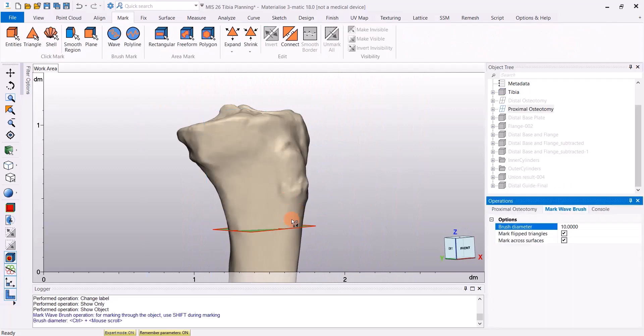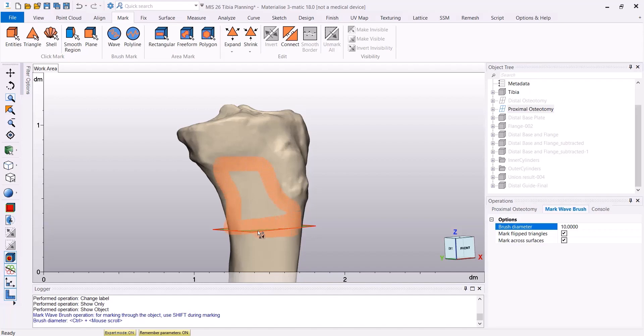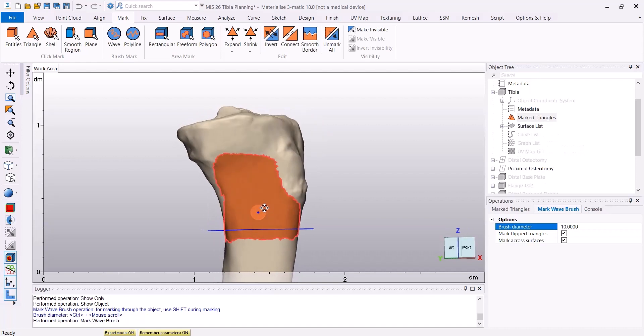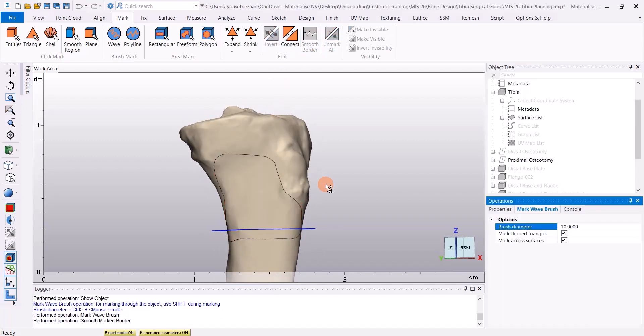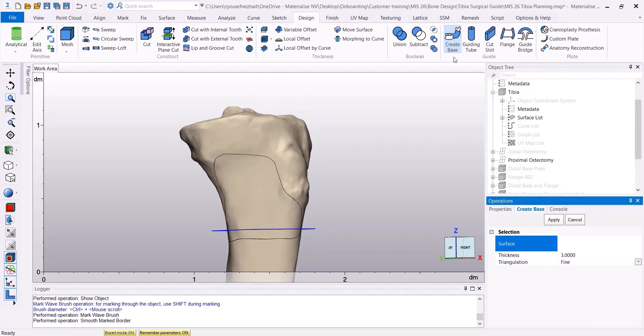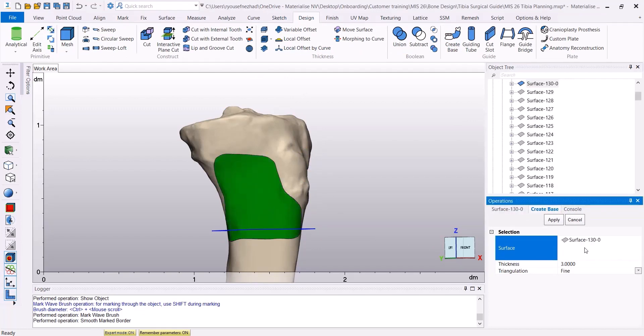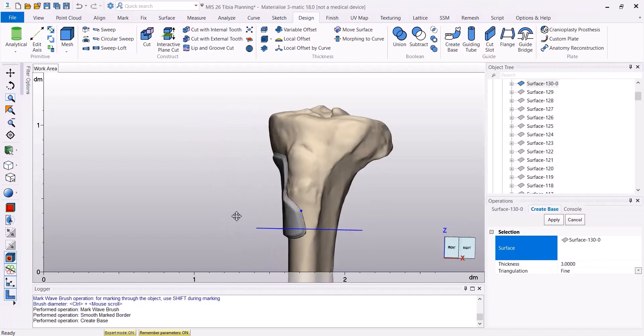For our second guide, we're going to mark above the proximal plane, just as we have done before. After the triangles have been marked, we're going to smooth the borders using Smooth Border tool. Then we're going to create the base for our guide using the Create Base tool under the Design menu.